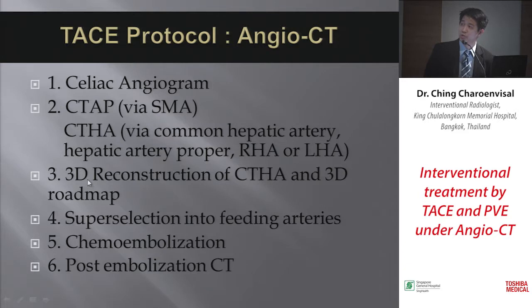And then we do the 3D reconstruction of the CT-HA and do the 3D road mapping. And then we super-select into the feeding arteries, do the chemoembolization, and do the post-embolization CT.